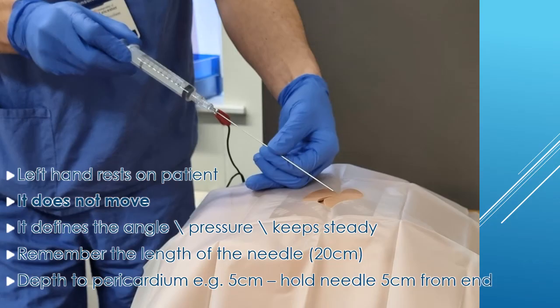Instead, this is the approach that I would recommend. Your left hand rests on the patient, and it rests with your knuckles down like this so that you can comfortably hold the needle between your thumb and your index finger. This hand doesn't move from the patient for the entire procedure. And this hand is the critical one for defining the angle of your approach, the pressure that you're applying, and it helps to keep everything rock steady because you're not floating in space, you are resting on the patient.